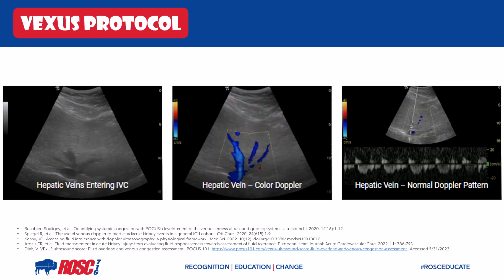Once we've identified the hepatic veins, we're going to go ahead and activate pulse wave Doppler. We're going to place the pulse wave Doppler gate on the hepatic veins right before it enters the IVC. We're then going to activate our pulse wave Doppler, and we're going to go ahead and get our spectrogram that we see here. One thing to point out is that hepatic vein Dopplers are strongly influenced by tricuspid regurg, and this may influence our interpretation.